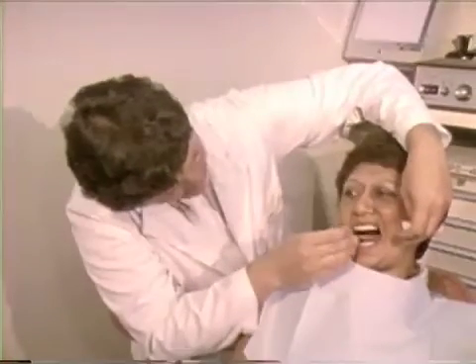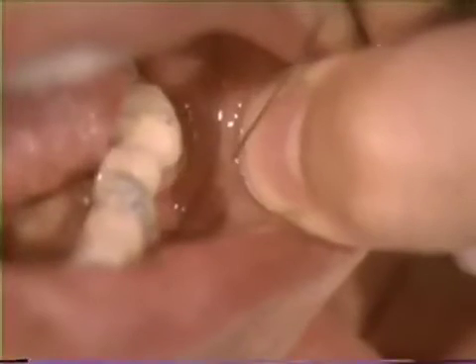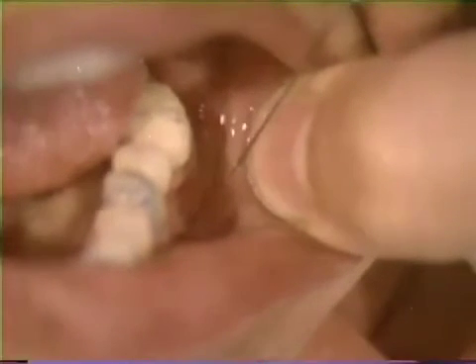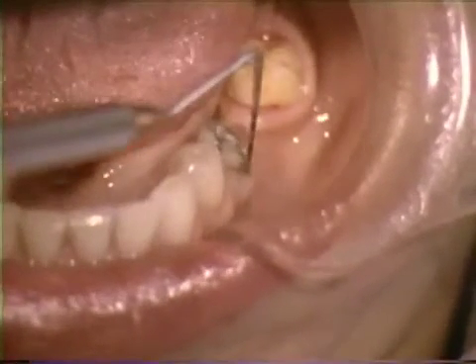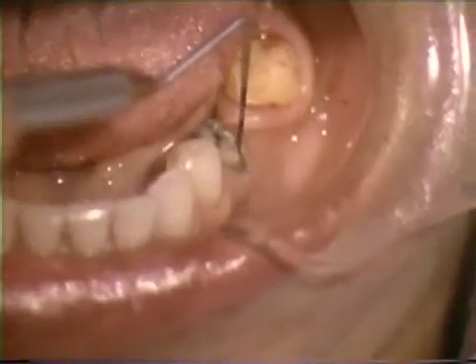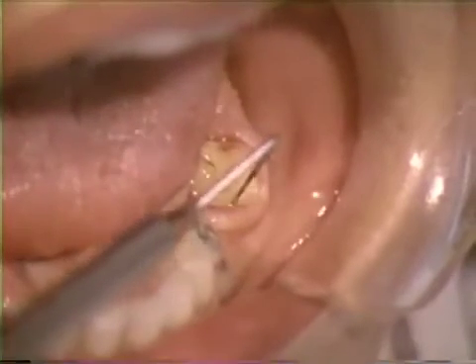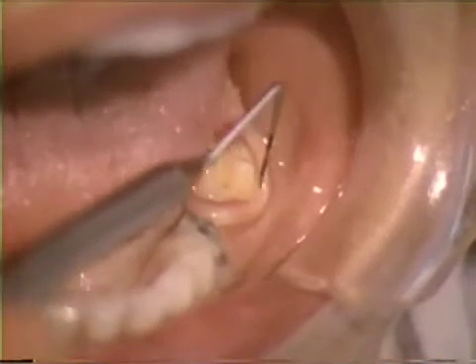All areas to be surgerized must be anesthetized. The electrosurgical procedures to be demonstrated will be a gingivectomy of a second bicuspid and molar, removal of hyperplastic ridge tissue, and sulcular preparation prior to an impression procedure. Prosthetic treatment for this patient will be the placement of a three-unit fixed bridge replacing a missing first molar.